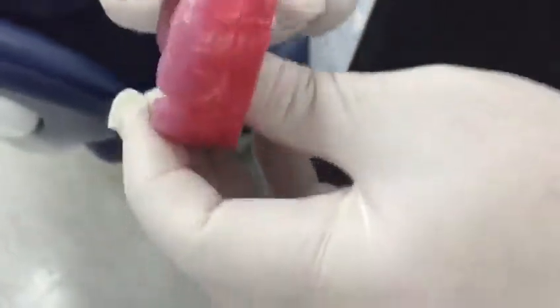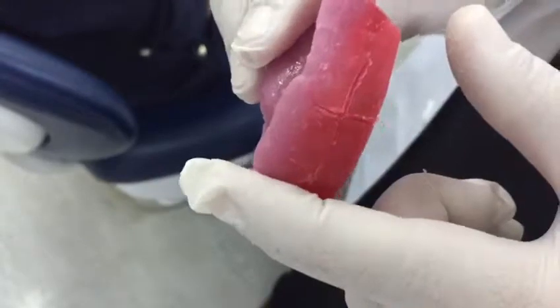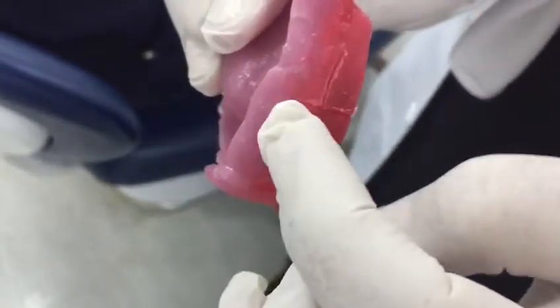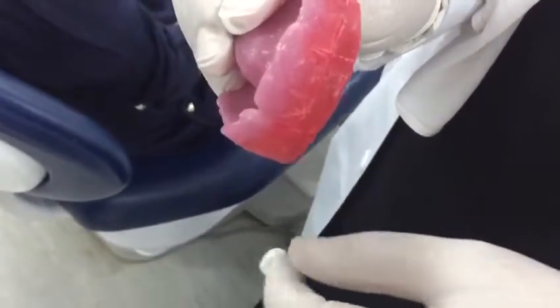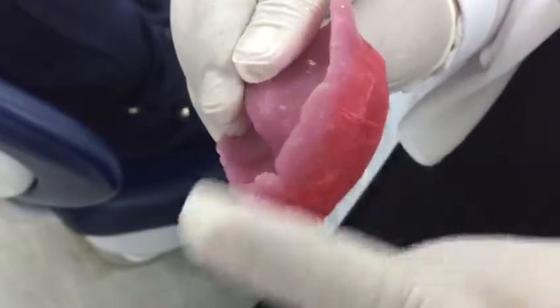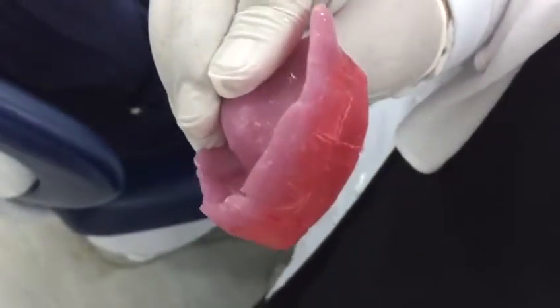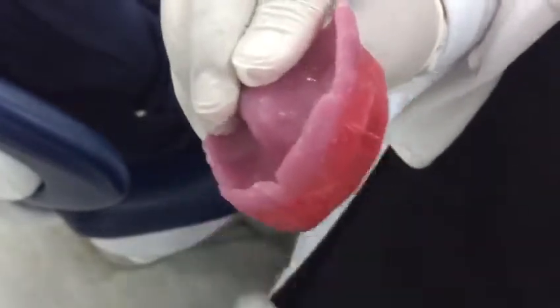Try to reduce from this base plate as much as possible. But if it thins out and you find it sharp, you can even create a window. To solve bulging from the acrylic of the base plate: first, trim from the canine to the canine area. If that is not enough and it's very thin, you can also remove the labial flange totally.